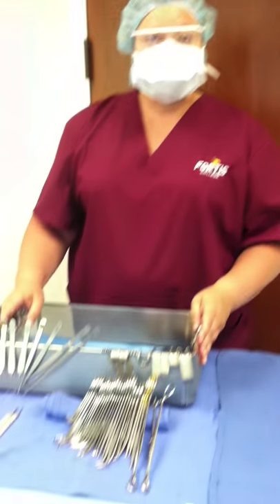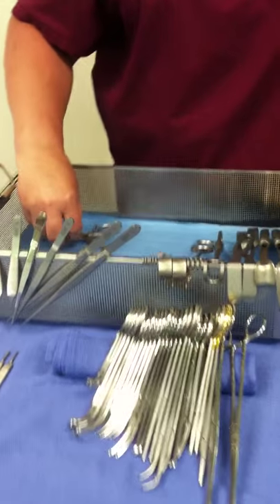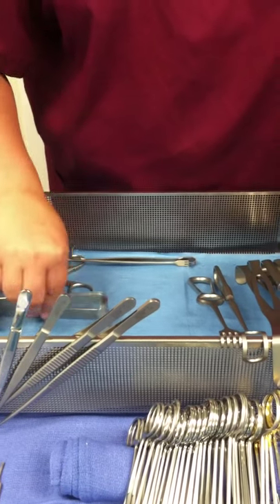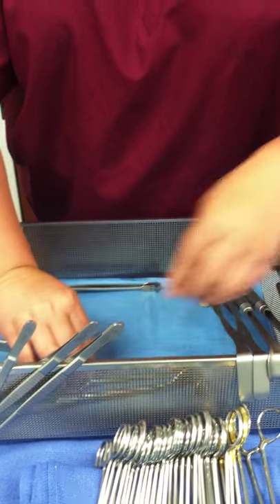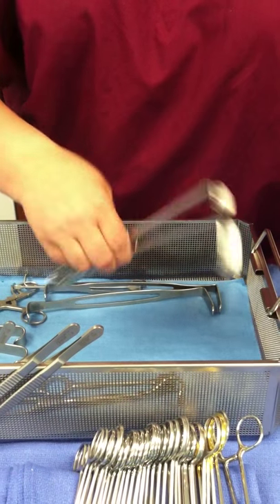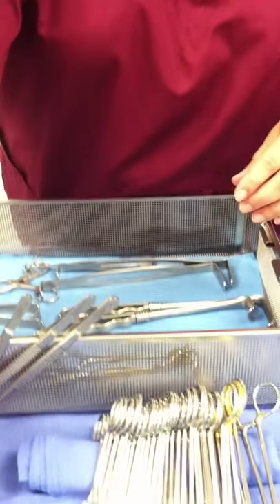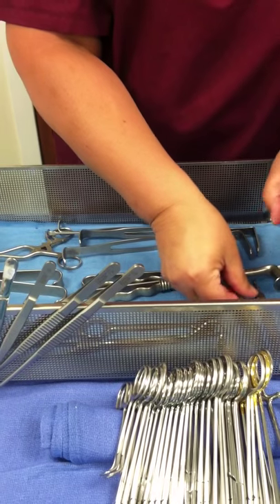We'll start. You put your retractors — just lay them in here nice and neatly. Any which way is fine as long as it's done neatly. And your knife handles, just nice and neatly.